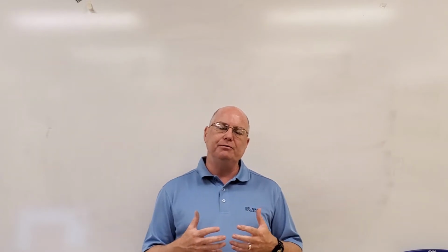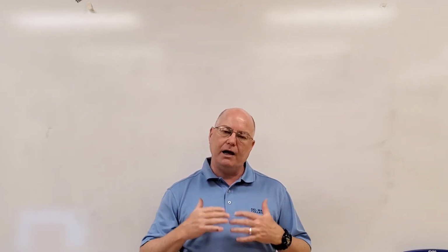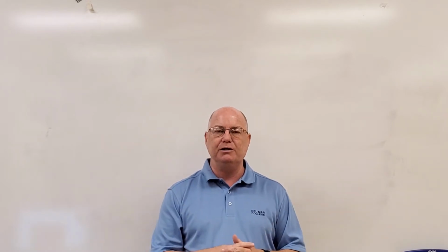This video is going to be an introduction for my laboratory to connective tissues. So I'm going to go over connective tissues as much as I can, and then I will show you what the slides look like all in this video. I like to draw them out first so that you can get a good idea in your head of what you should be looking for, and then I'll show you the slides.